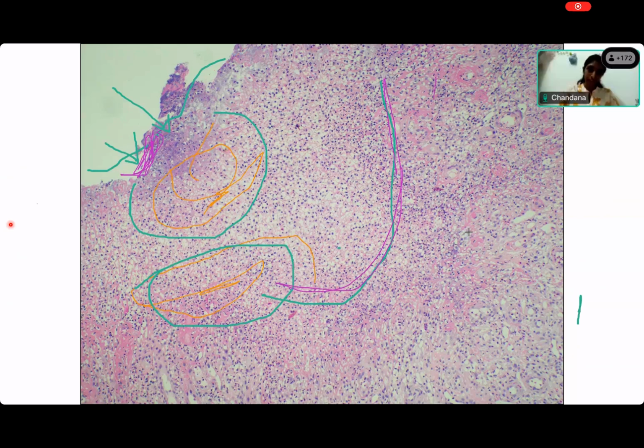Okay. Ma'am, I think this is the base of ulcer. Which one, Chandana? What color are you using? Pink color, ma'am. Okay, so where is it? I can't see your pink. Can anybody see it? Maybe use the second pen? I'm right below Priyambada. Yeah, there's a pink line in the center. It disappeared. All right, so you've done the same.